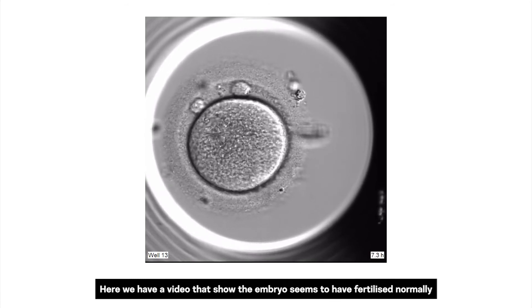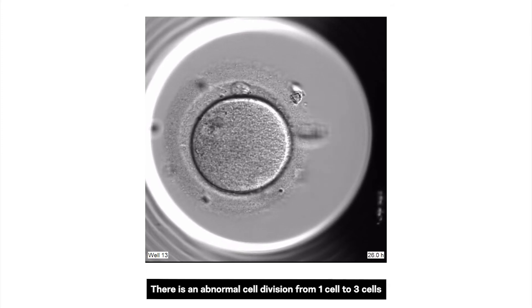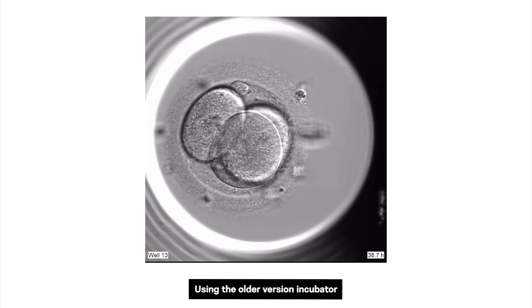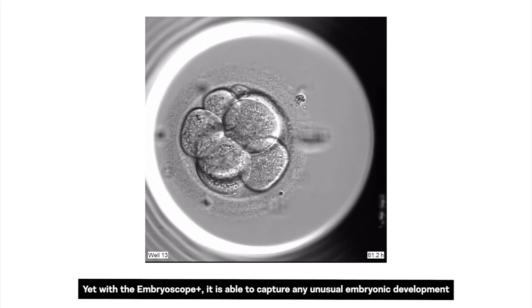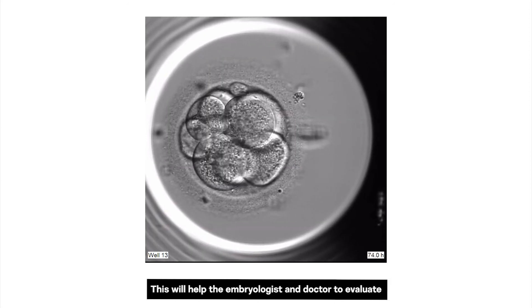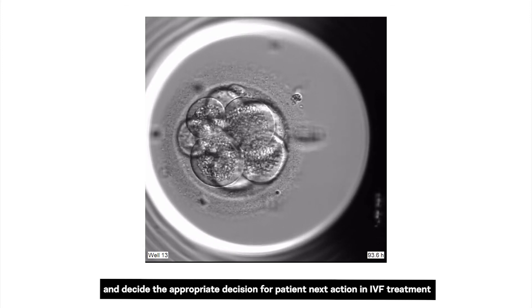Here we have a video that shows the embryo appears to have fertilized normally. However, when we assess the video carefully, there is an abnormal cell division from 1 cell to 3 cells. Using the older incubator, we may have assumed that the embryo had grown without any abnormality. Yet, with the Embroscope Plus, it is able to capture any unusual embryonic development, helping the embryologist and doctor evaluate and decide the appropriate course of action for the patient's next step in IVF treatment.